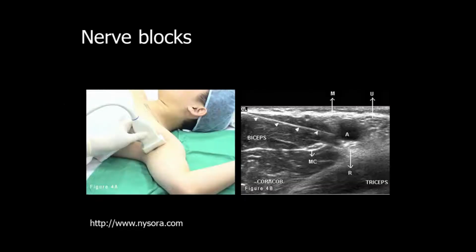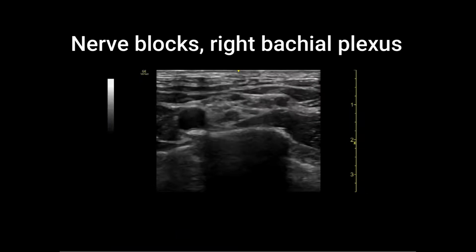You can use it for nerve blocks, and here you can see an inline approach in which you can see the whole path of the needle. You can use this also for vascular access, although when you're doing neck lines, jugular vein, this is much more difficult, so out-of-plane insertions are done. Just showing nerve blocks, here you have the subclavian artery, and you can see the depth.